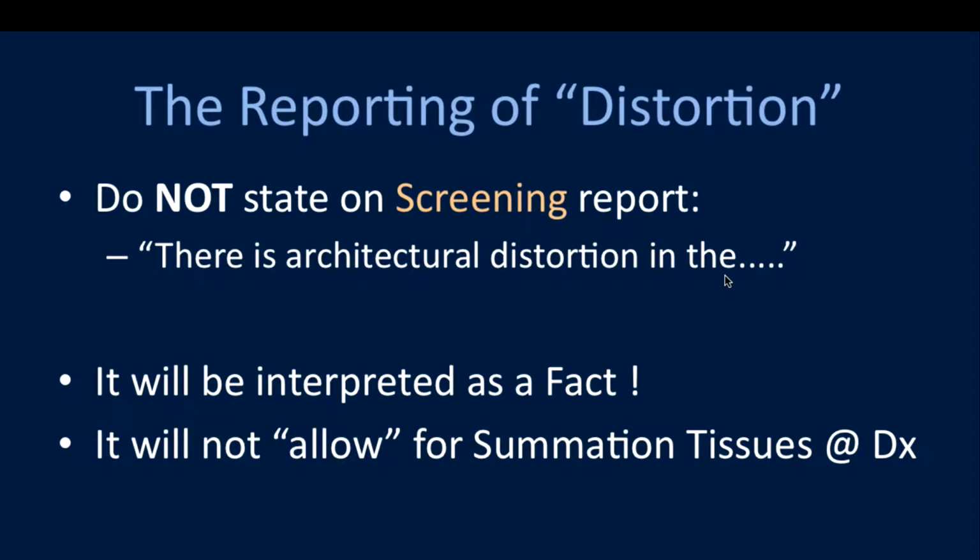And now this radiologist has this situation where, well, doctor, you said it was there, and now you say there isn't there, and now this is where it grew. Don't you know what's going on? So in your screening report, remember the screening examination, if you call that patient back for additional views, it's not an abnormal exam. It's incomplete. You need additional data to figure out whether the finding is real.